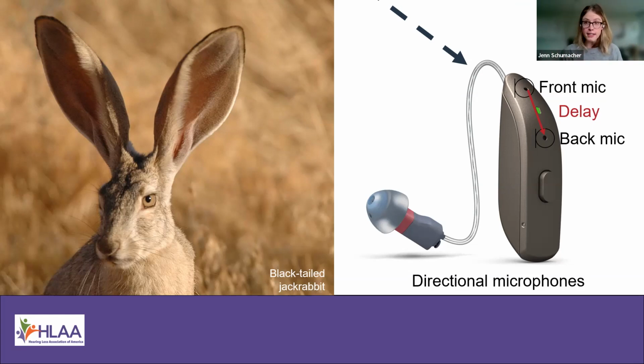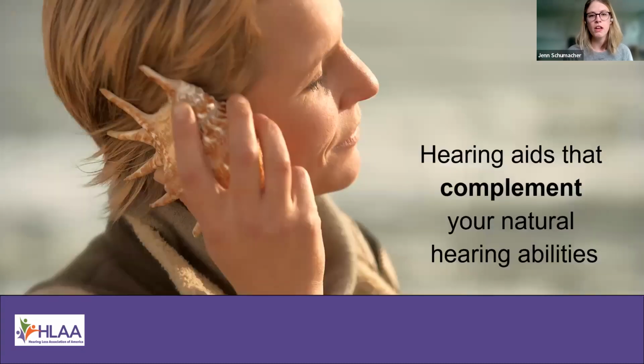Usually human behavior dictates that when we are talking to somebody, we are looking at them. So the hearing aid microphones take that knowledge of human listening behavior and focus in on the front. And then when you have a sound coming from behind or even to the sides of your head, the hearing aid microphones can actually cancel those out, or at least not amplify them, not send them into the system to be amplified for you to hear. So all hearing aid companies have this technology, and it's been around for a very long time. We've all been using it for a long time.